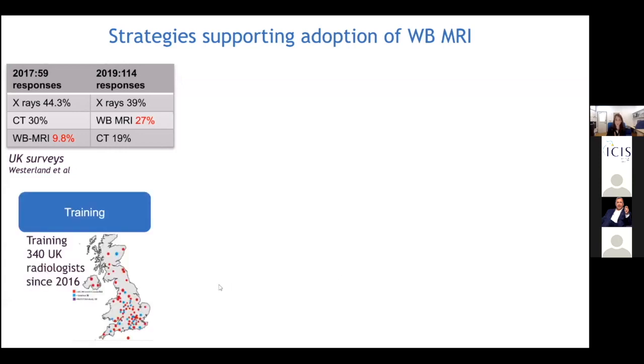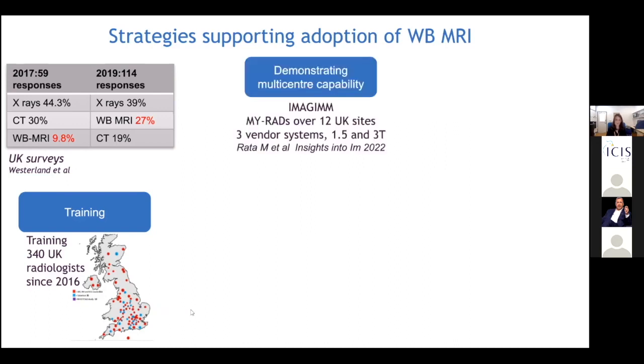One of them is education, and ICIS, and you'll hear a little bit more about this, I hope, has done a huge amount in terms of training for whole body MRI. And we have another interactive course in December of this year in London. And so we hope that this effort in training has contributed to increased availability. We've also shown that MY-RADS can be applied prospectively in clinical trials.